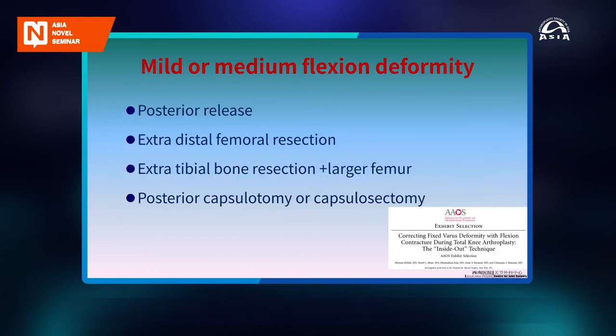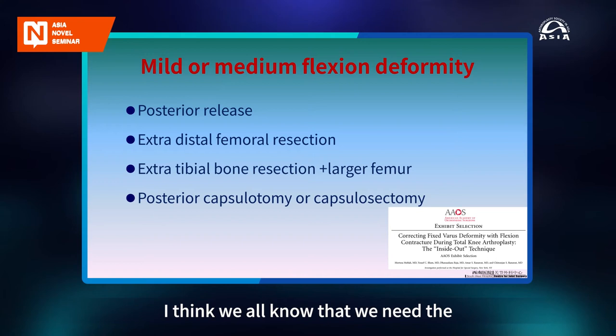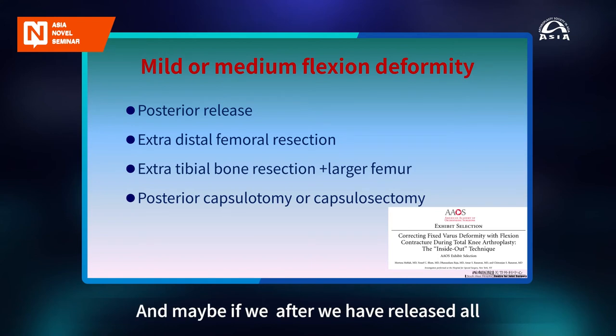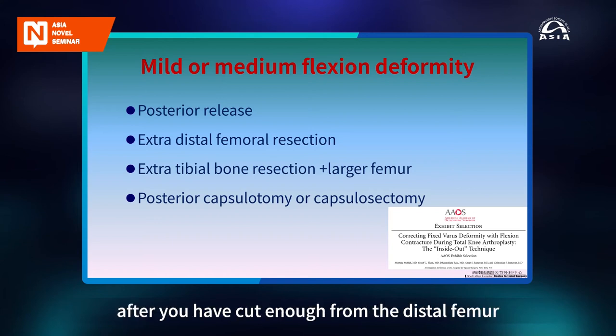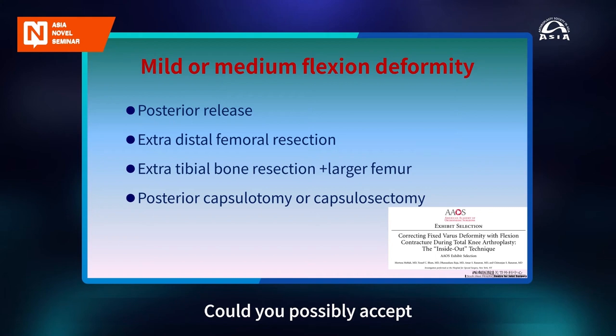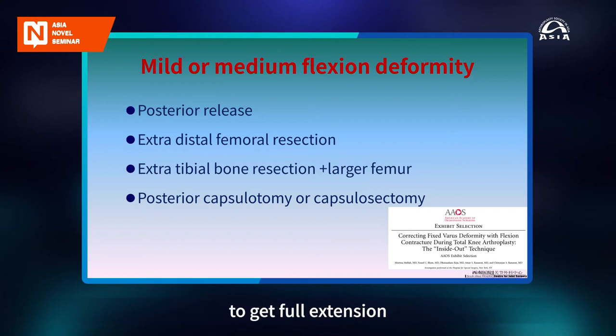So for mild and medium flexion deformity, I think we all know that we need some posterior cleaning and the posterior release of the capsule. And maybe after we have released all we can, we need extra distal femoral resection. And we are going to discuss how much extra distal femoral resection you can accept. And maybe for some difficult cases, after you have cut enough from the distal femur, could you possibly accept cutting more tibia to get full extension? Then you need a larger femur to fill the gap of the flexion gap. And do you need the posterior capsulotomy to get full extension?